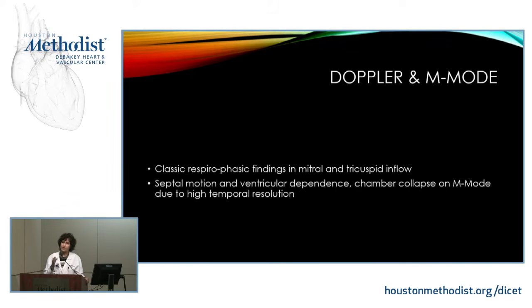Now, you are going to have slight septal movement, and in inspiration, because of the decrease in the intrathoracic pressure, you're going to have a pulmonary vein pressure drop, but at the same time, you're having a concomitant drop in the intra-atrial pressure. So you're still having a driving gradient on the left side between the pulmonary veins and the LA, and you're going to see a normal inflow.